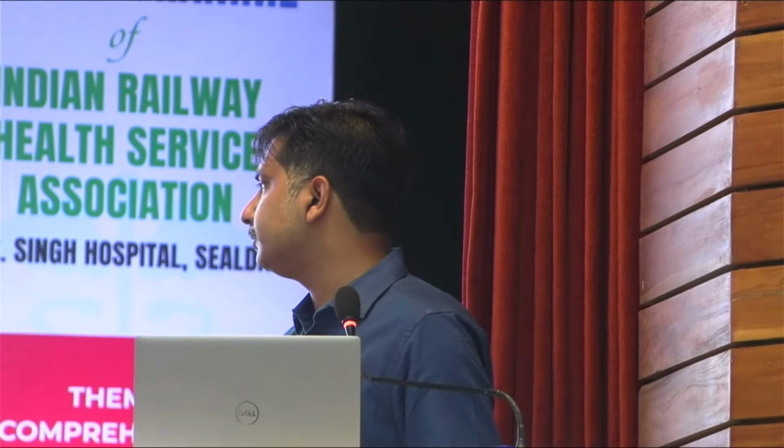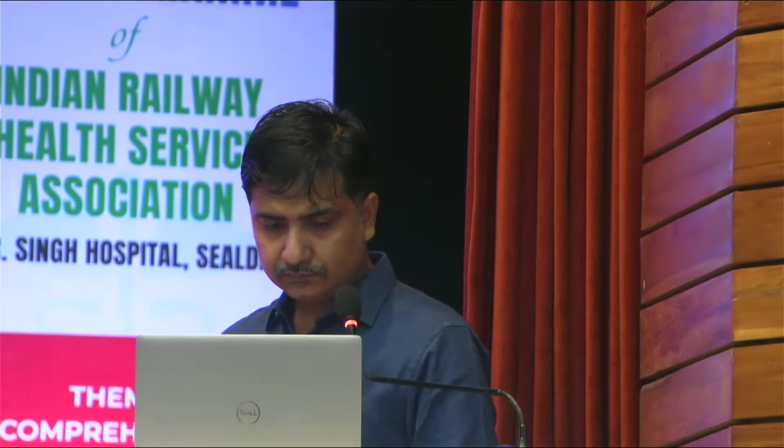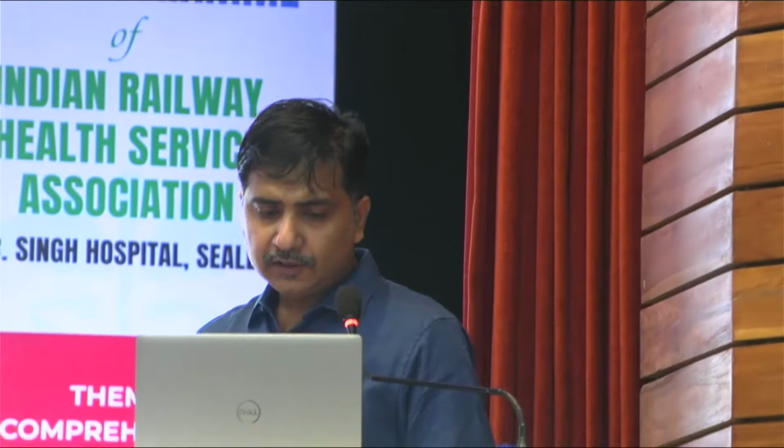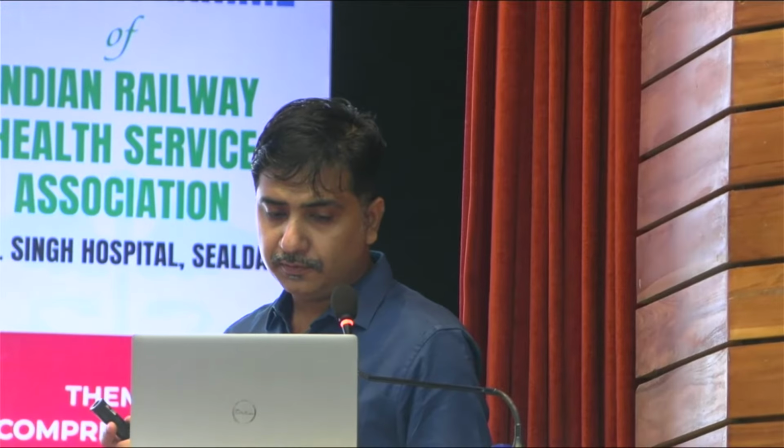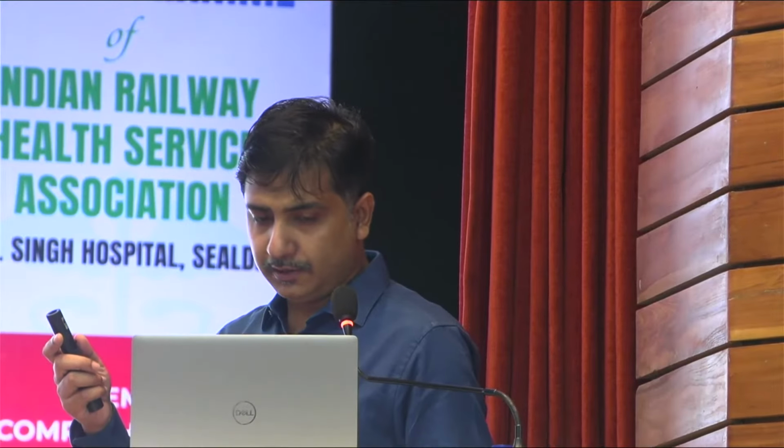It is an easier approach for conduction system pacing because it gives almost the same magnitude of benefit. So this is the left bundle area anatomy. Now I am going through it in short. The left bundle consists of the left anterior fascicle, left posterior fascicle, and the common left bundle.